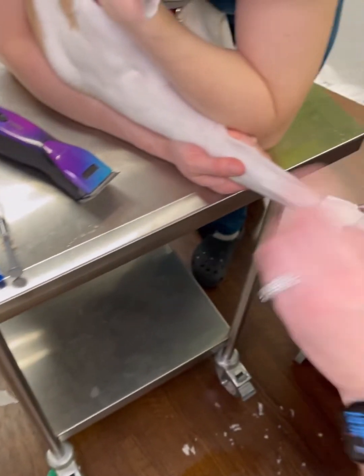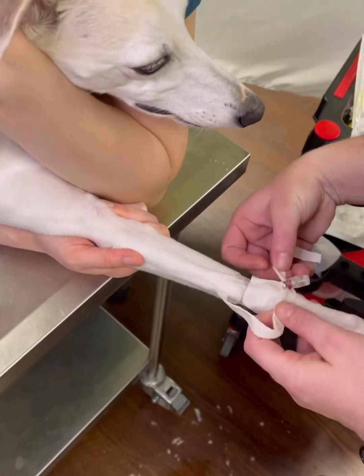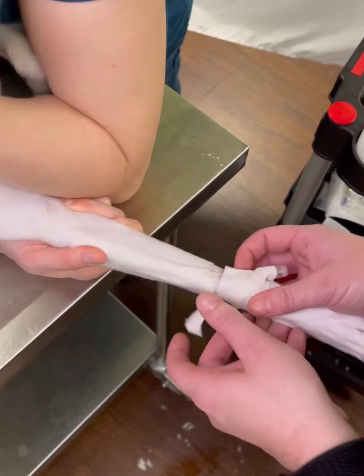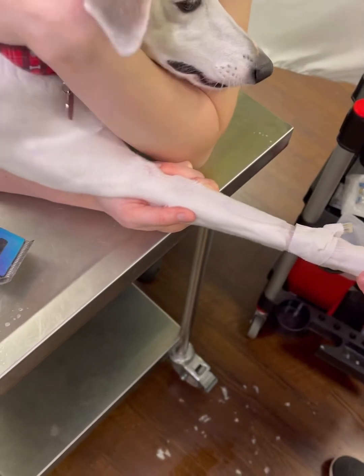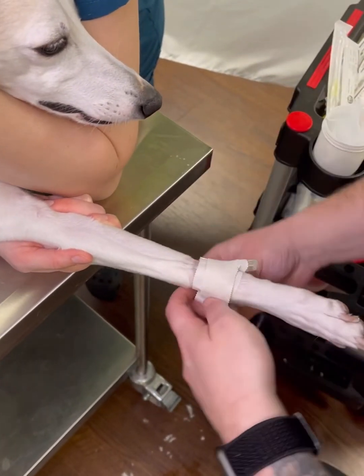Your third piece of tape is another skinny piece. You're going to place it sticky side up under the cap about halfway through the piece of tape, folding it over each side. Then your last piece is going to be a thick piece of tape, and it's just going to kind of go over all the rest of the tape.